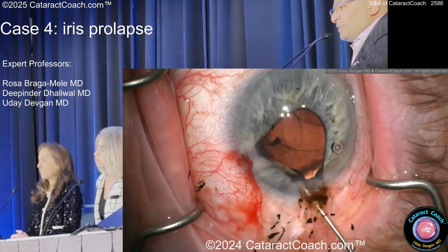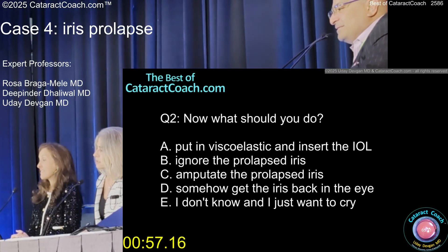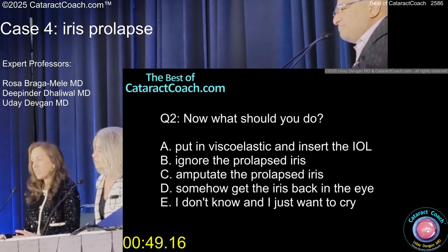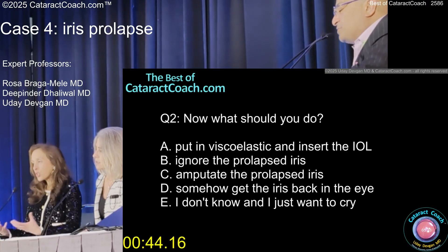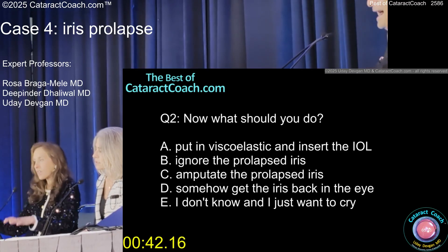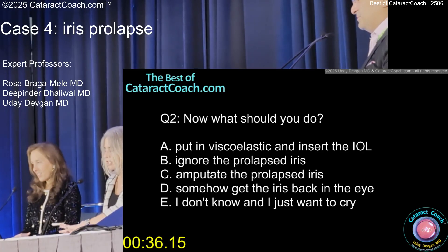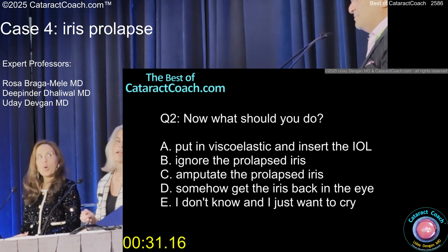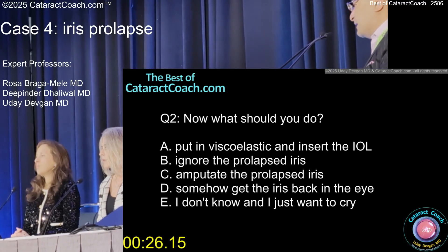At this point, I do want to cry. And of course, it has to be a blue-eyed patient so you can see every little defect. What do you want to do now? Decompress to get that iris back — you have to understand what's going on. You need to visualize. So put viscoelastic back in through the side port to push that iris down, then place one iris hook sub-incisionally to hold that iris down and out of there. The one sub-incisional iris hook is going to prevent it from prolapsing again and again.